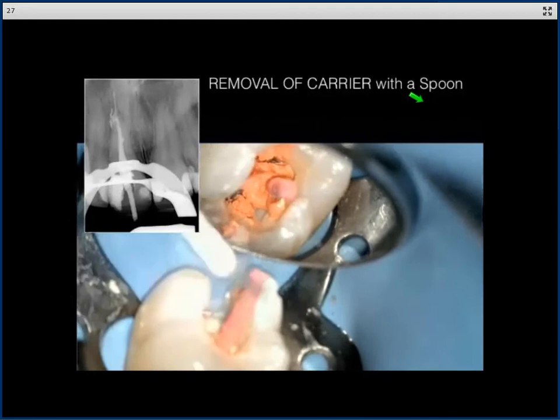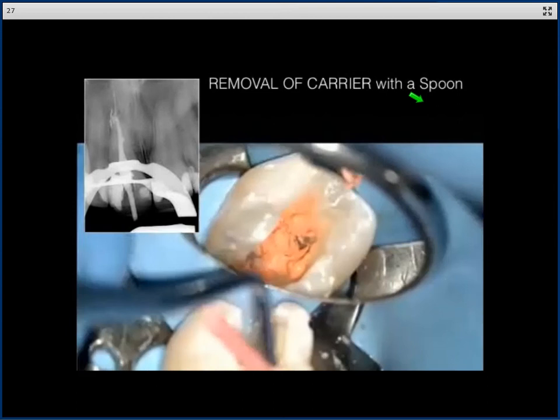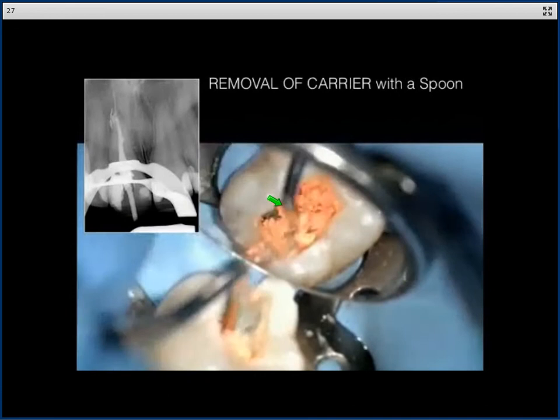I personally like to use a spoon to do this, a sharp spoon excavator. So you don't have to go out there and buy any new instruments. You don't have to use a burr. In fact, I recommend you don't use a burr, but just let this gutta percha set for maybe about half a minute. Some people even blow some cold air at this. And then removing the excess gutta percha, which is in here, is actually quite simple. What I do over here is just remove it with that spoon. Again, not rocket science whatsoever.